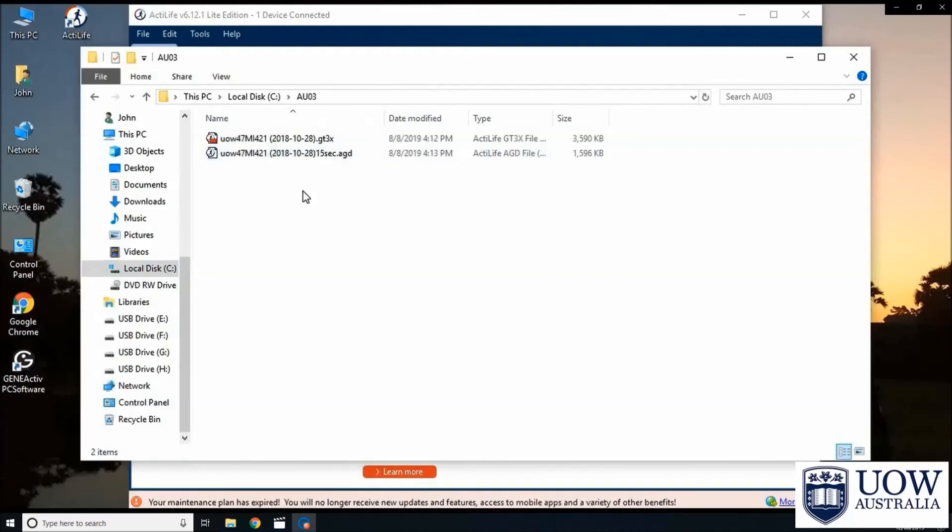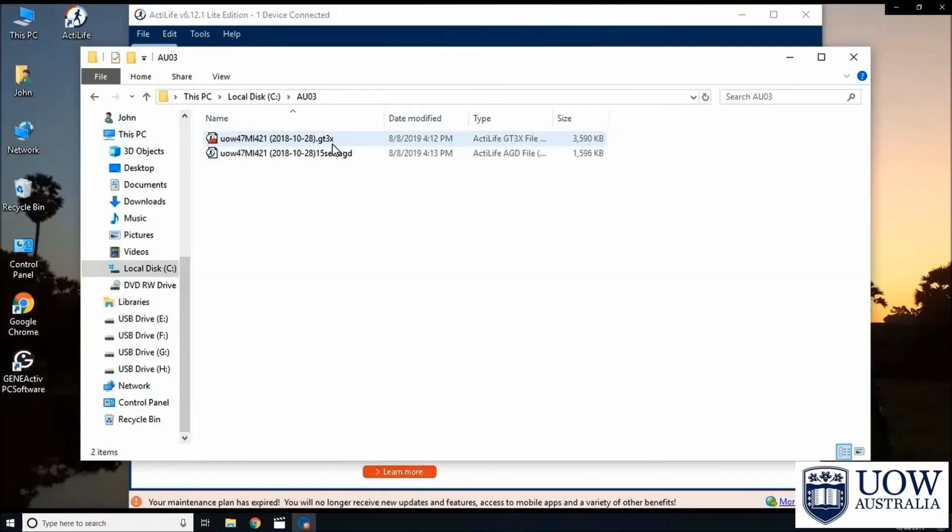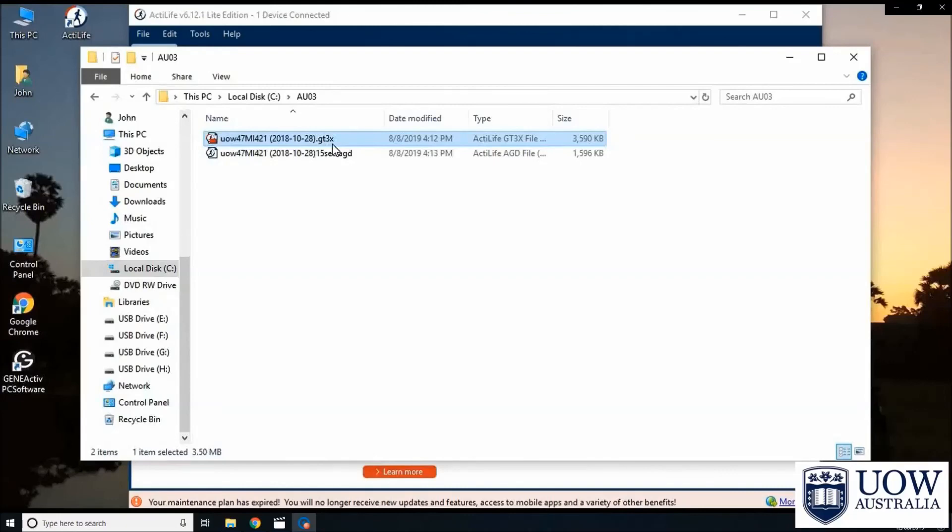One data file will be in the GT3X format, which is the larger file. The other file will have the letters 15 seconds added to the end of the original file name with an AGD extension.